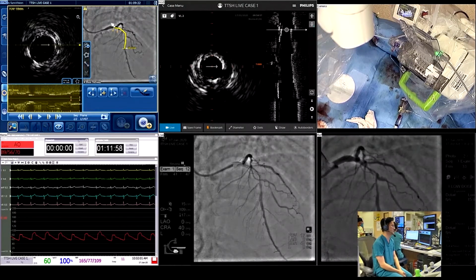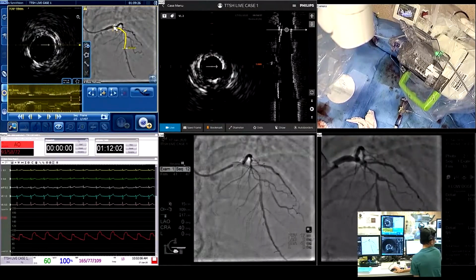And so can we just quickly measure this? So, Paul, what would you rely on? The screen is 40. Because this gives you 40, and on robotic precision, you had around 33, isn't it?